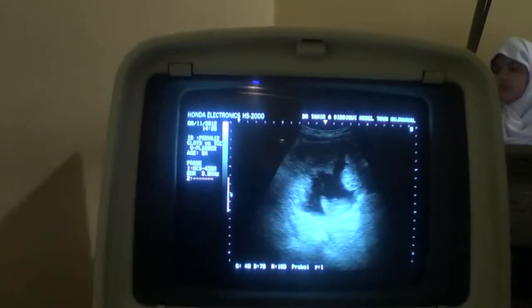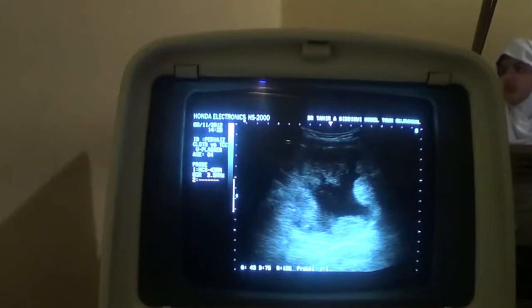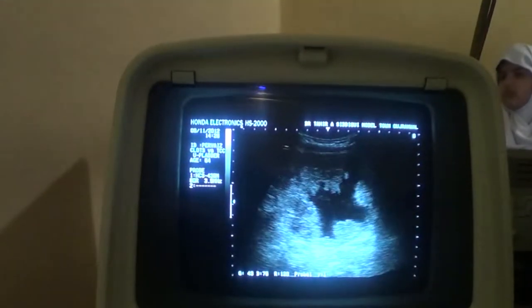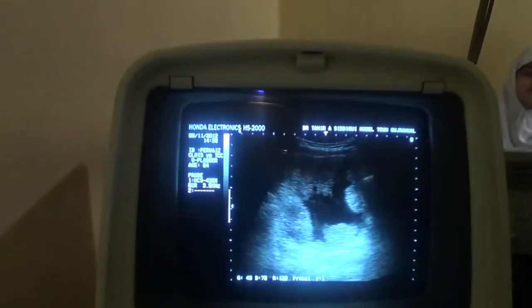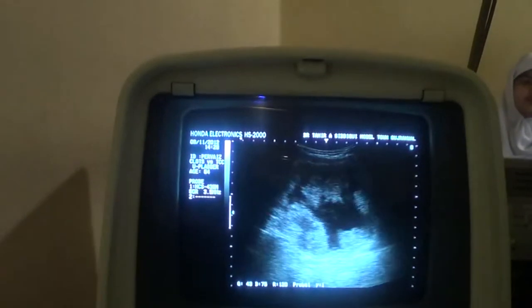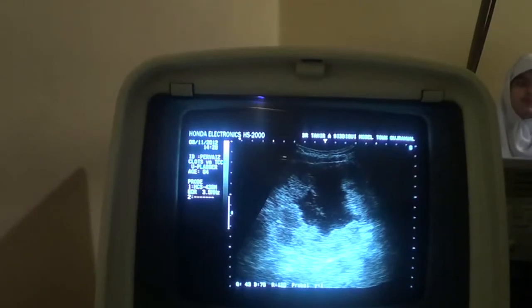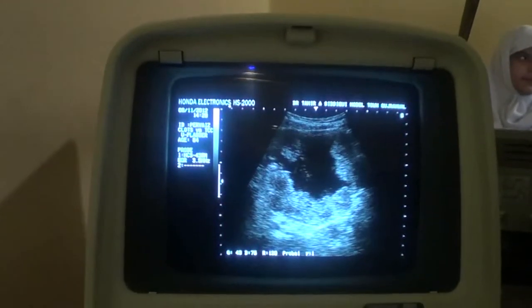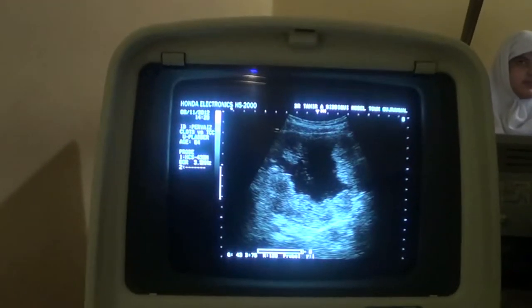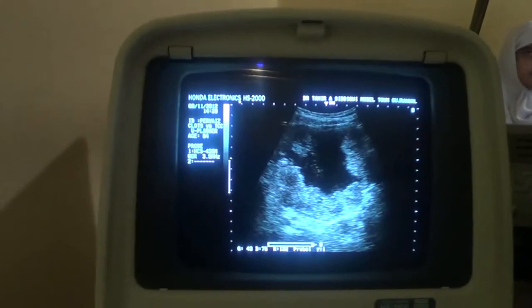That I will say that the dense coarse echogenic areas having irregular outer surface, merging together at the lateral walls and the posterior wall of the urinary bladder, is most probably in favor of transitional cell carcinoma. However, we should keep the bleed or clot formation in mind.